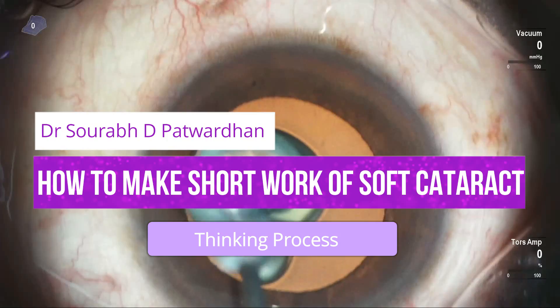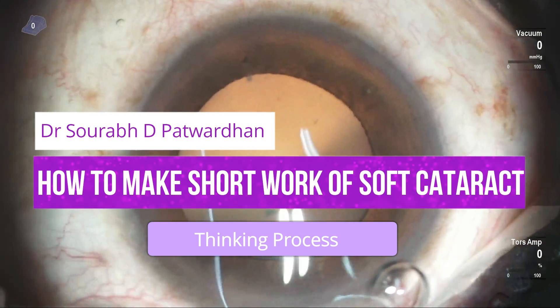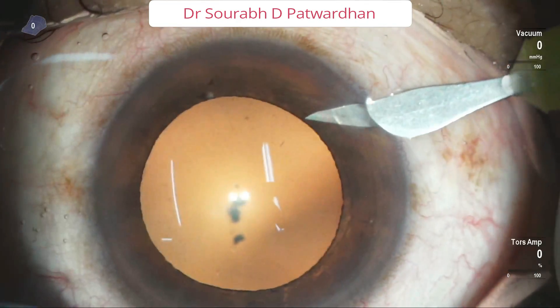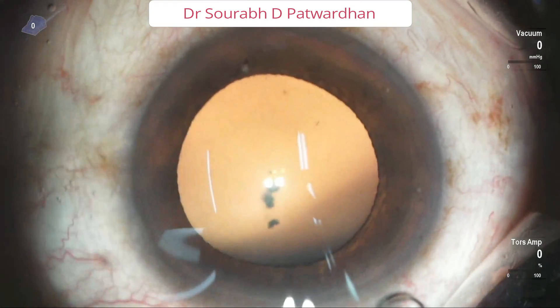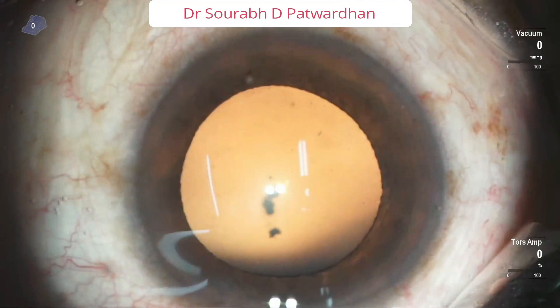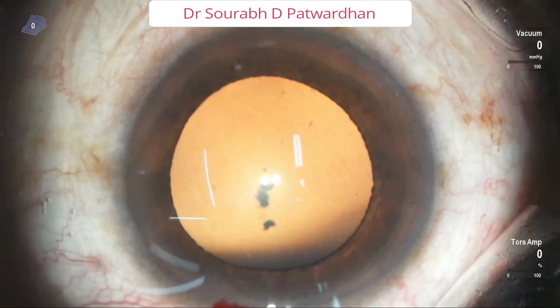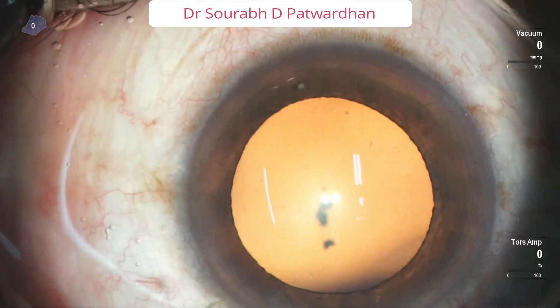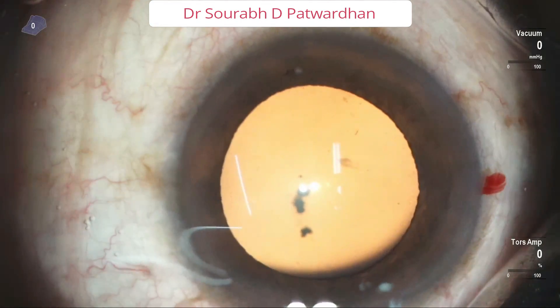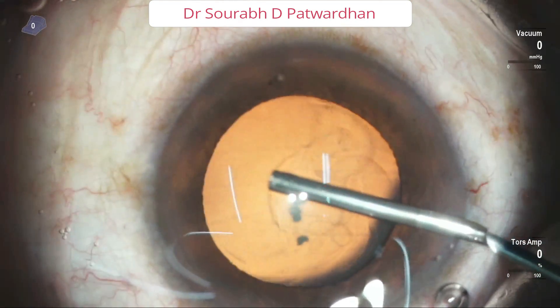Hello friends. In this video I will be talking about how to tackle the soft cataract. It is often said that softer cataracts are harder to tackle, but it is not so. The only difference is that the technique to use in soft cataract is different from those which are having nucleus sclerosis. Nowadays we often get softer cataracts because patients are more aware and come at an early stage, and we also have younger patients getting cataract. So it is important to understand how to tackle this properly and what is the thinking process to do this phacoemulsification with least complications.